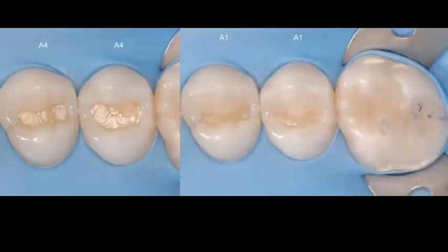And this is where the concept of successive cusp buildup technique starts. And there's a couple of ways that you can go about this. As you can see, both of these preparations were really not that deep. But even though they were not that deep, I want to make sure that I don't have any voids between the first layer and the dentin layer, the superficial dentin that is on the bottom of my preparation. So that's the reason why you normally want to start your successive cusp buildup technique with a horizontal layer.